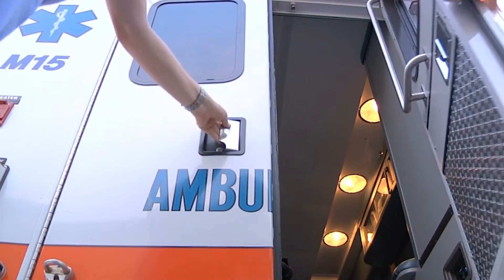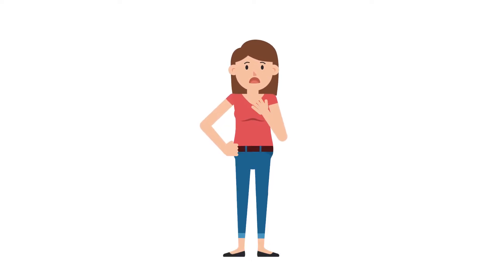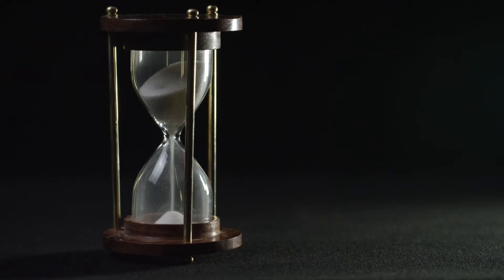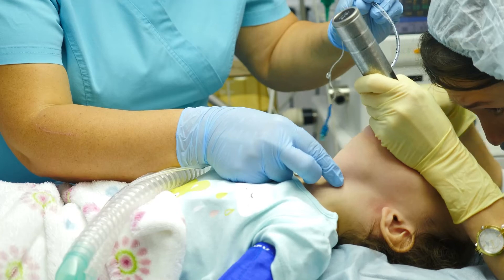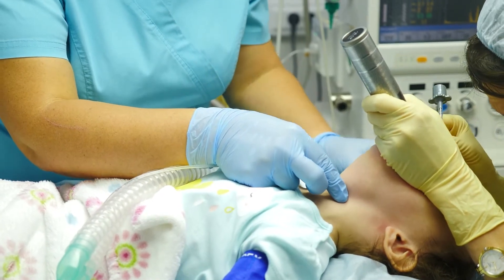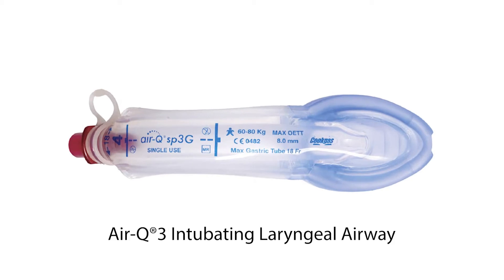First responders know that maintaining adequate oxygenation for patients who cannot breathe effectively or on their own is critical. Unfortunately, time is not our friend in these situations. The ability to establish an effective, secure, and safe advanced airway is imperative. Thankfully, the Air Q3 is setting minds at ease.